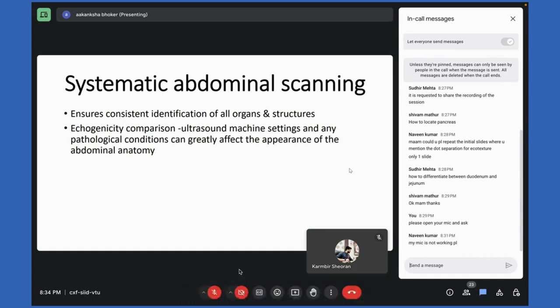Ma'am, can we use a human machine for the animals? Yes, definitely, we can use it. The only thing that will happen when we are using a human machine is that it does not have pre-installed packages, which simply give you an instant calculation for veterinary use. For that, the cost is increased a lot. But if we have a human machine whose cost is less, with almost all similar features, the price will vary by a factor of two.